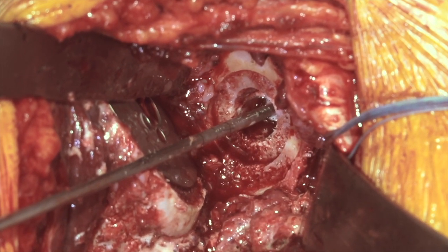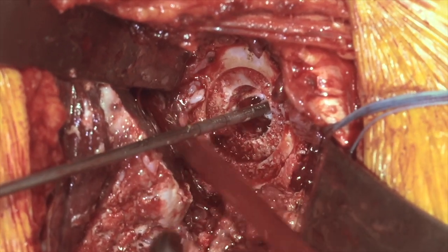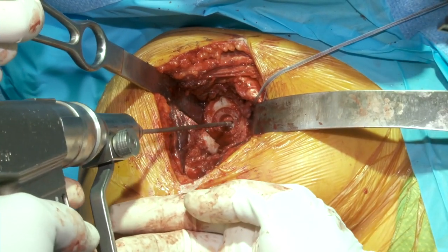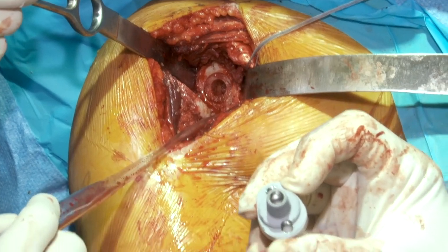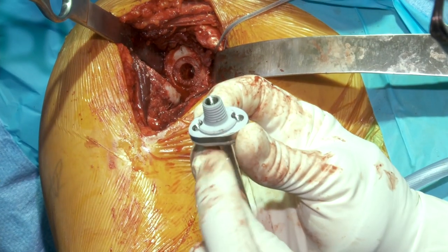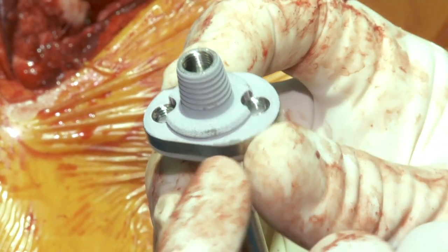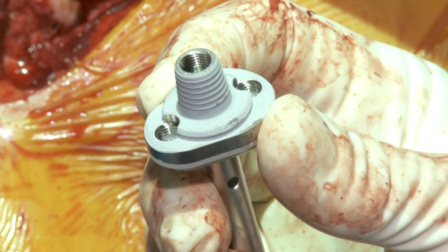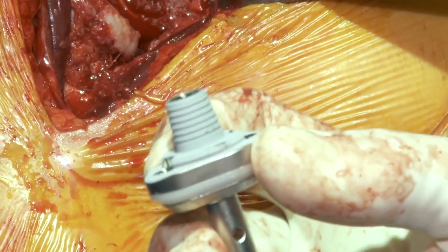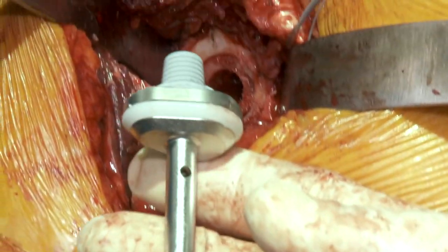We want to remove a little bit more of the soft tissue to make sure it doesn't get interposed between the implant and the glenoid face. We'll take our guide pin out and then take our anatomically designed glenoid component. This glenoid component has two levels, which is why we have double-level reaming — this provides a tremendous amount of surface area for bone ingrowth. It also has macro ingrowth with grit blasting, and on top of that is a coating of Bonit, which is calcium phosphate, allowing bone ingrowth. This is very stable by its design and geometry at time zero and has excellent characteristics for bone ingrowth into the implant.